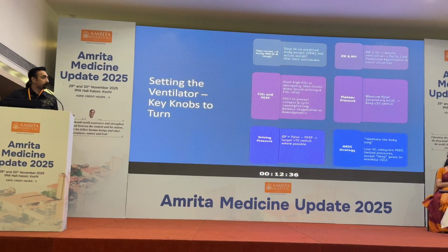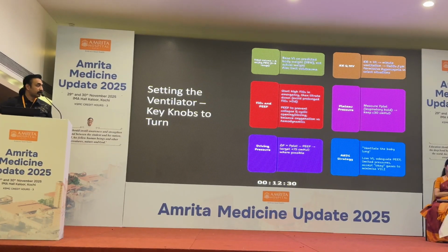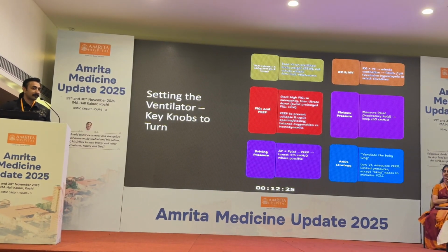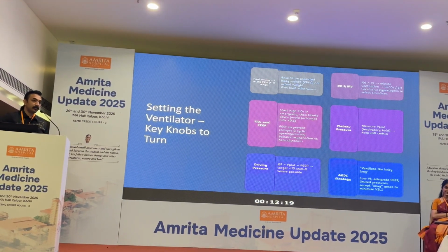It's your PCO2, right? And then you have your FiO2 and PEEP, which is going to help manage your hypoxia, right? Okay. Plateau pressure. Heard about plateau pressure? ARDSnet criteria, you remember?